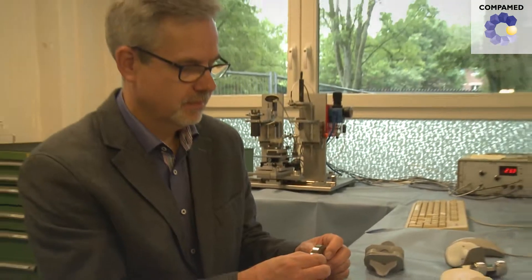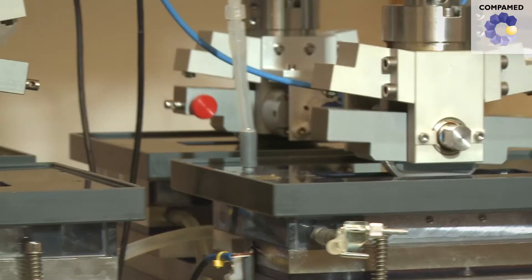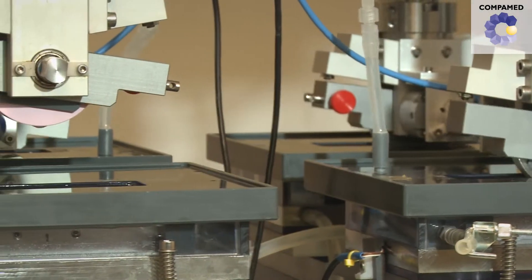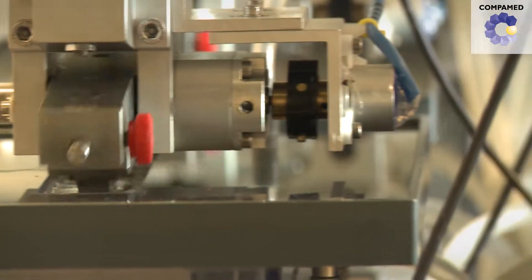Christoph Hirschler and his colleagues at the Biomechanics and Biomaterials Laboratory LBB at the Hanover Medical School study the wear and tear of all-ceramic knee prosthetics. To do this, they developed a test facility that mimics the motion and strain of the knee joint.